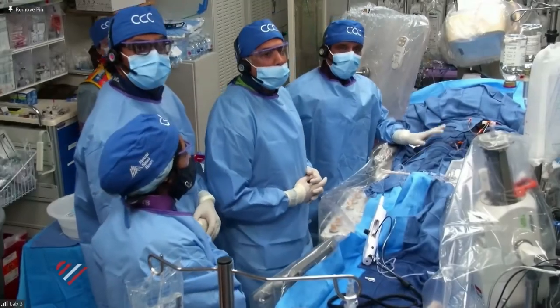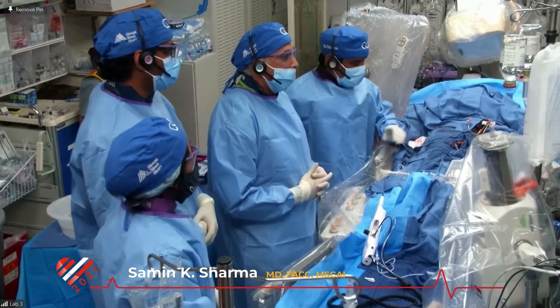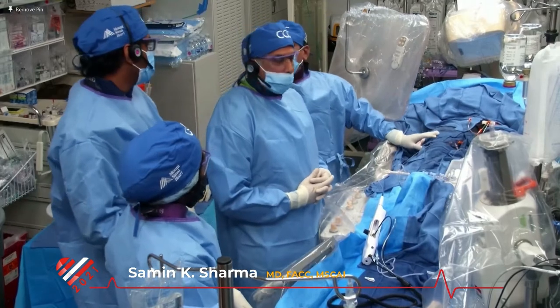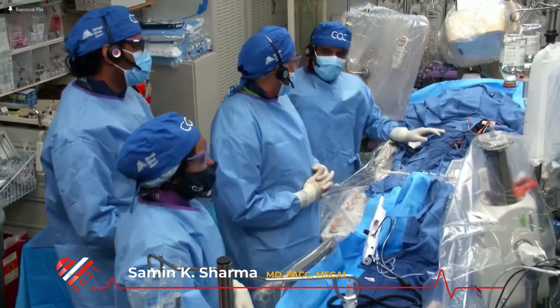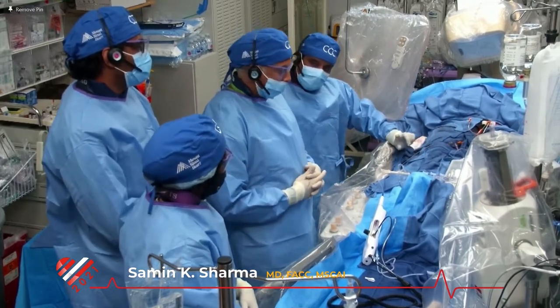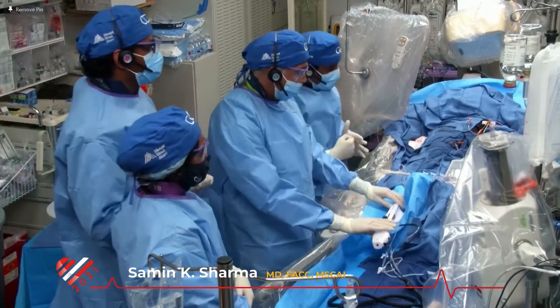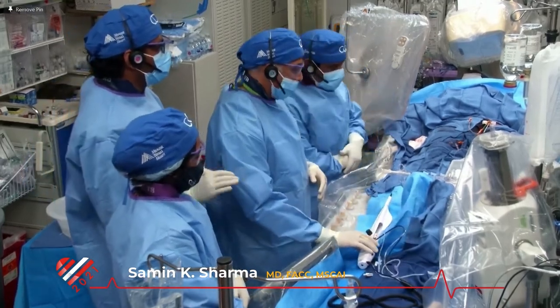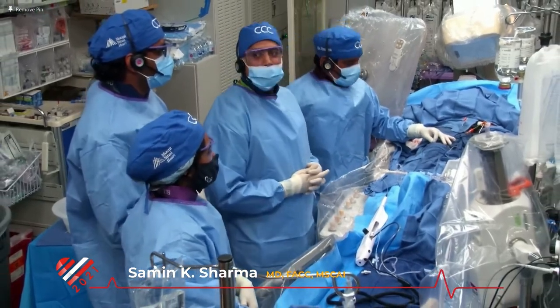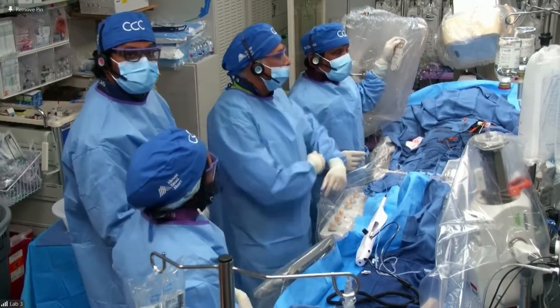We are ready here. Case two - let's go for case two. Room three means case number two. On my right side, Dr. Barman, and we have our fellows. We can't even recognize with so many masks and caps. Akash, and all the fellows are there along with our CAT Lab staff - Twinkle, Vicky, and Ashley. So we welcome everyone for this live hybrid meeting.